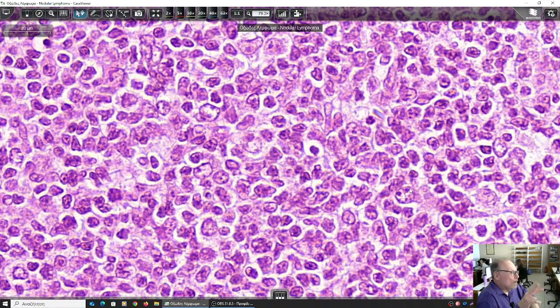Oh, no, that's another way. That's how apoptosis is performed, Fas and Fas ligand. Yes. Excellent. They express BCL2. These lymphomatous lymphoid follicles express BCL2, showing that there is no apoptosis.